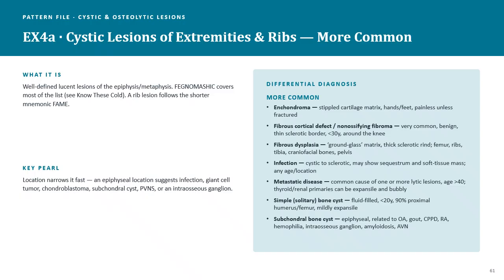When we're talking about an aggressive osteolytic type lesion, that's also destroying the bone itself, it's going to look dark, but the edges are going to be what they call fuzzy.